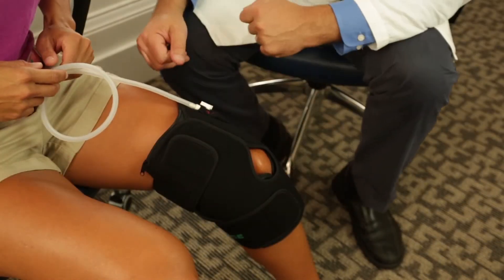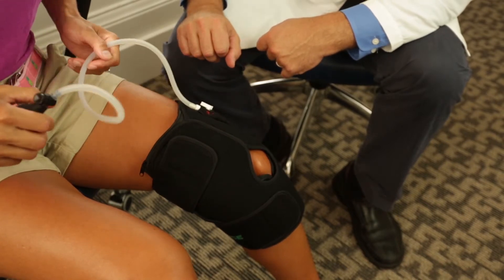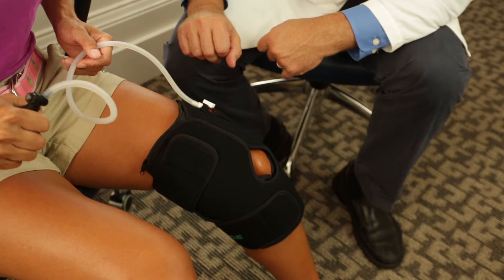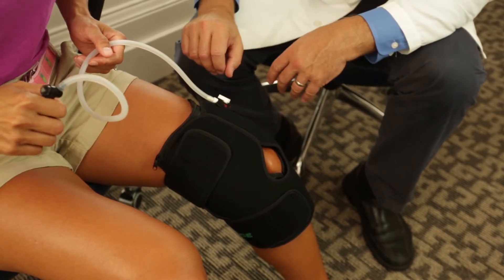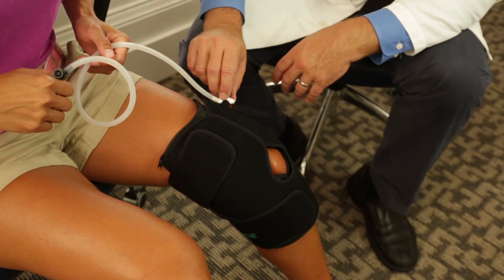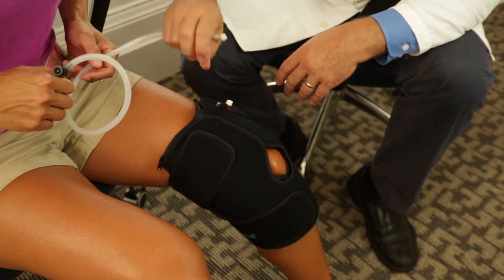From there, you'll attach the tube with the bulb to the valve. Switch the valve to on and inflate the brace to the desired compression. Once you're done inflating, switch it to off and remove the tube with the bulb. It's easy to do — once you've done it, you'll be on your way to achieving pain relief.